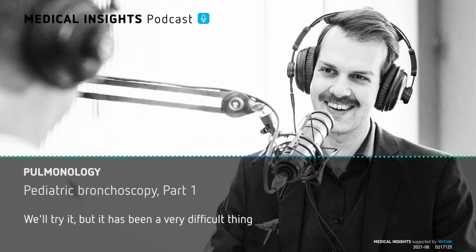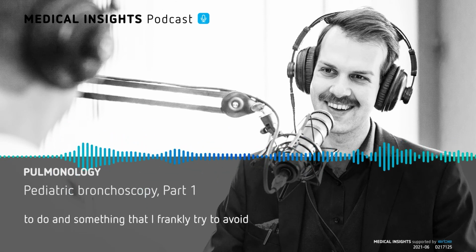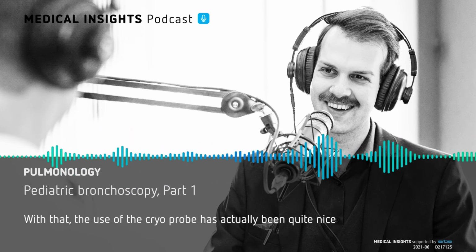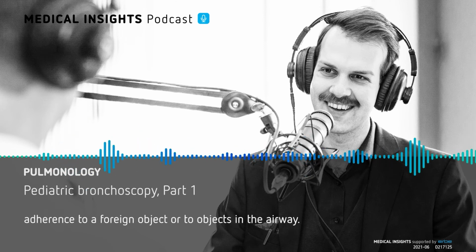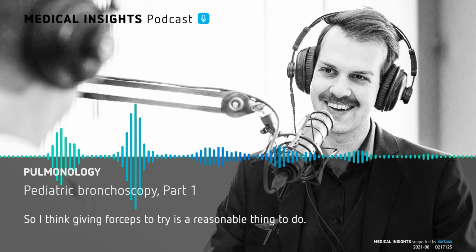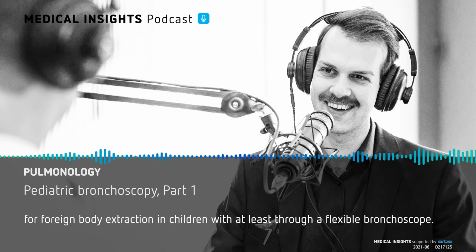We'll try it, but it has been a very difficult thing to do, and something that I frankly try to avoid when I can, just because of the limitations of the technology there. With that, the use of the cryoprobe has actually been quite nice, because I can get pretty good adherence to a foreign object or to objects in the airway, even in the smallest patients. So I think giving forceps a try is a reasonable thing to do, but I have been historically very dissatisfied with forceps in general for foreign body extraction in children, at least through a flexible bronchoscope.